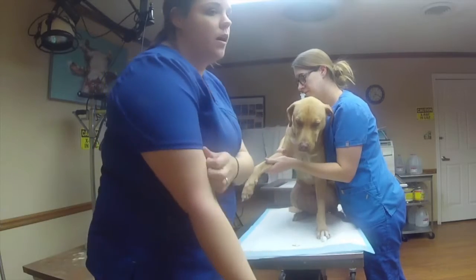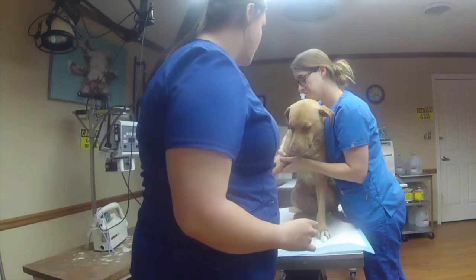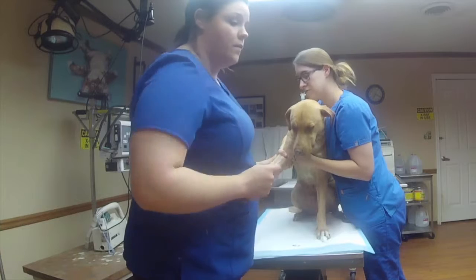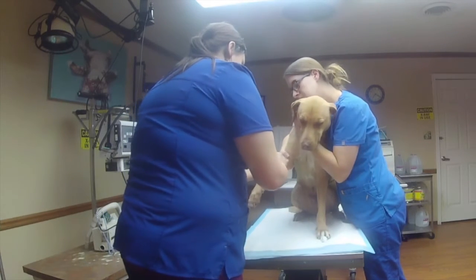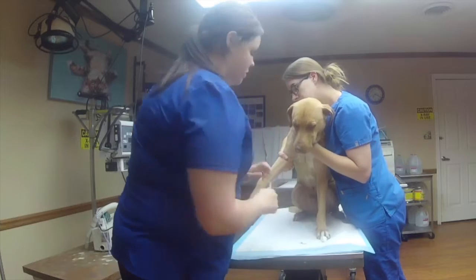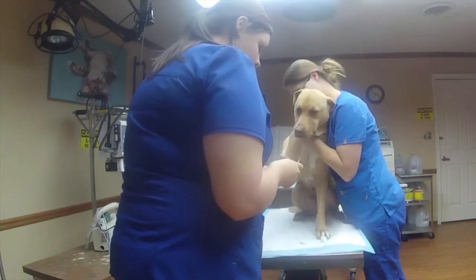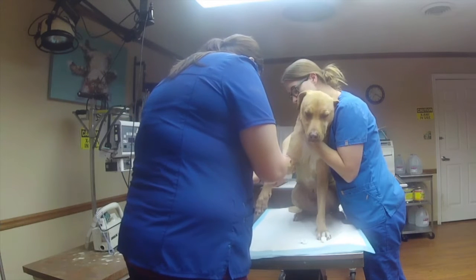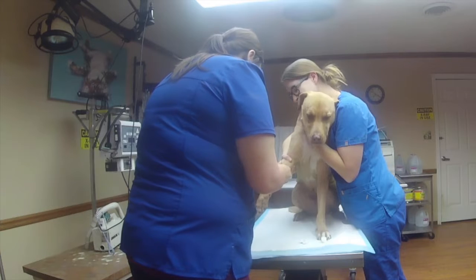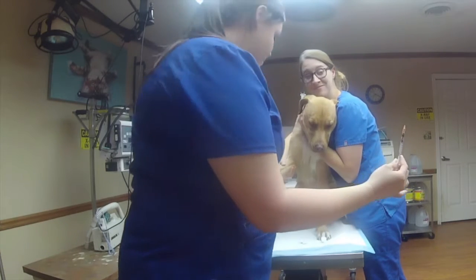You're going to draw off the cephalic vein of a canine. She's going to hold it off, depending on if you have help or not, or if it's a harder stick, will be dependent upon whether you want a tourniquet or not. So you want to make sure that the needle is beveled up. And that is how you draw from a cephalic vein.